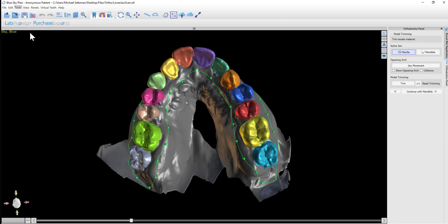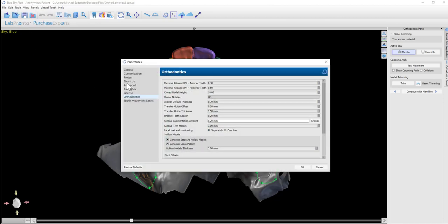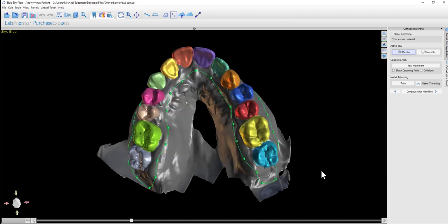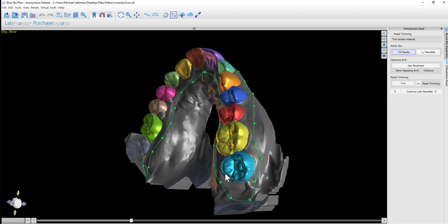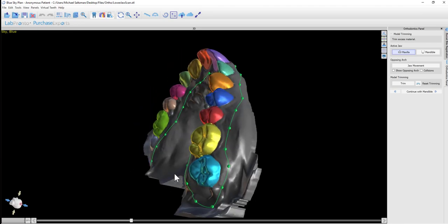If we go to Tools, Preferences, and Orthodontics, we see the gingiva trim margin at 3mm. In most situations, there's no reason to change that.